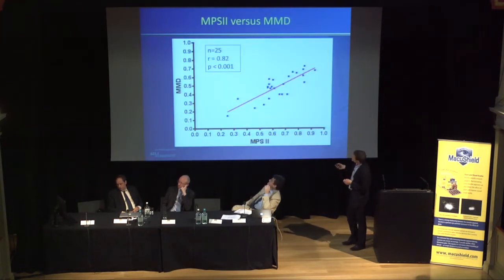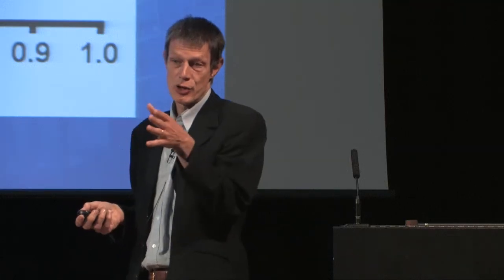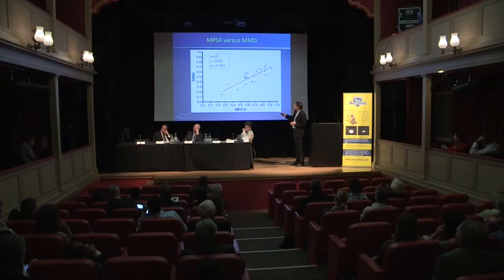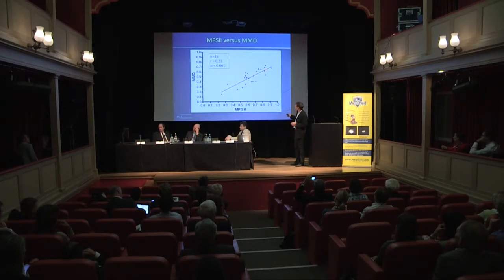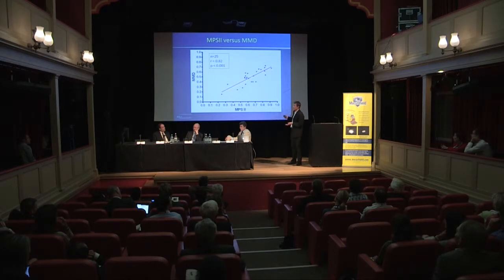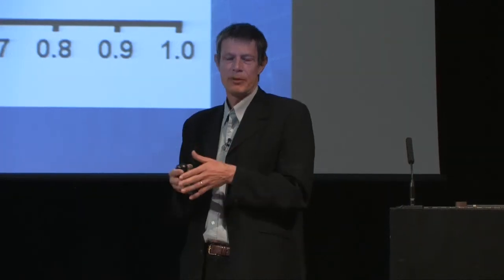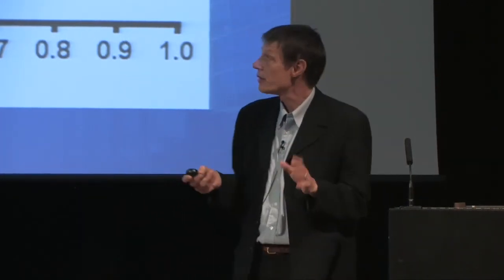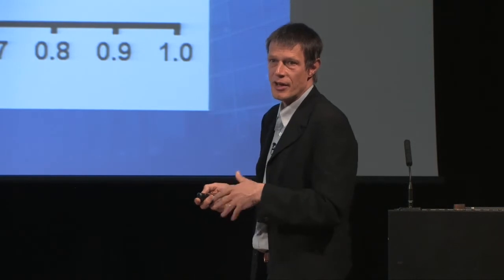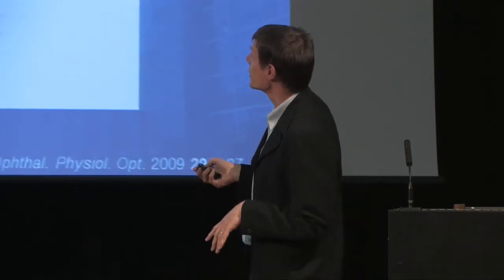And this is a comparison with Billy Wooten's device, which has been used in John Nolan's lab. Again, we see an excellent correlation as far as I'm concerned. So whether you measure with the MPS or the Wooten's device, the correlation is okay. It means having a high macular pigment density on one machine will give you a high density of pigment measurements on the other machine. The absolute values may differ because the actual widths may differ a little, but that depends. It's for all the setups which are available. You must use them within a setting, but to compare different machines, that's always tricky.